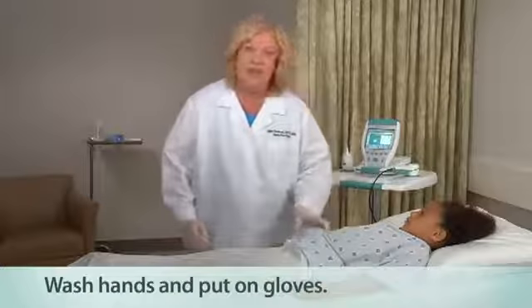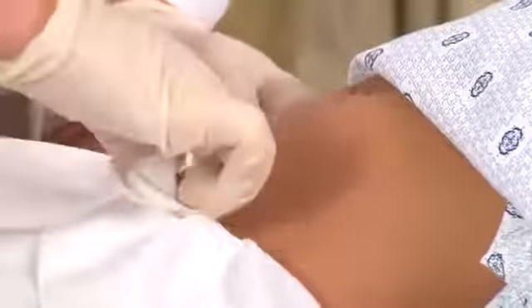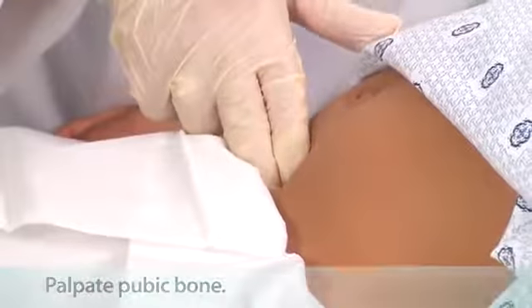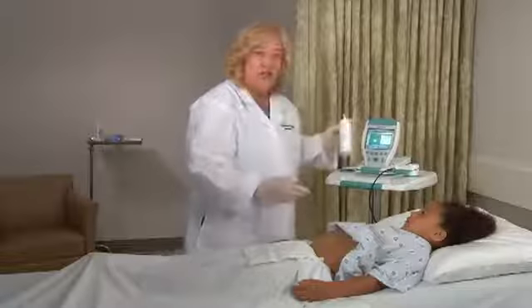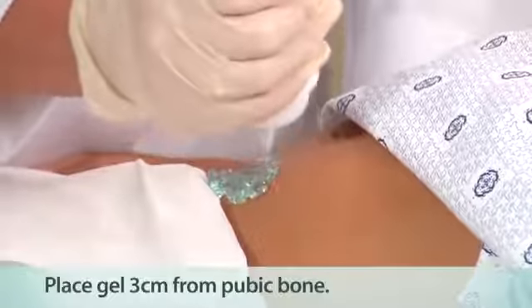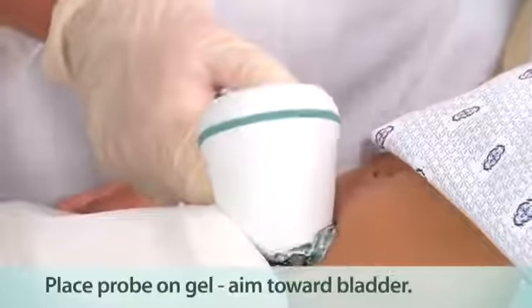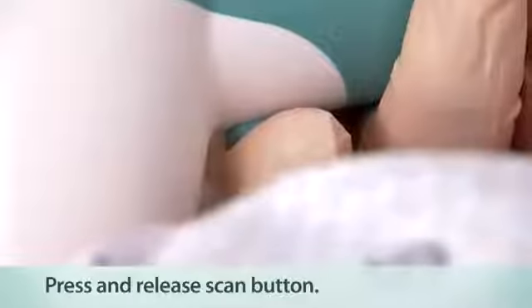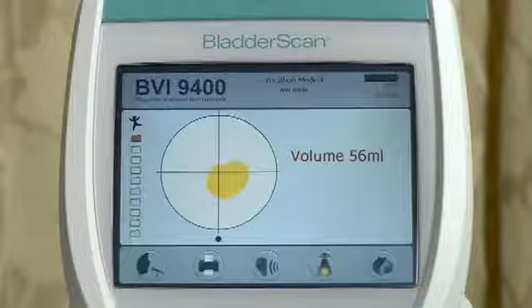Now this is how I prepare the patient before I perform the scan. Palpate the patient's pubic bone — the bladder is right behind the pubic bone. Take your ultrasound gel and place a generous quantity of gel midline on the patient's lower abdomen, about one inch or three centimeters above the pubic bone. Standing alongside the patient's right side, place the probe on the gel and aim downward behind the pubic bone towards the expected location of the bladder. Press and release the scan button located on the underside of the probe.